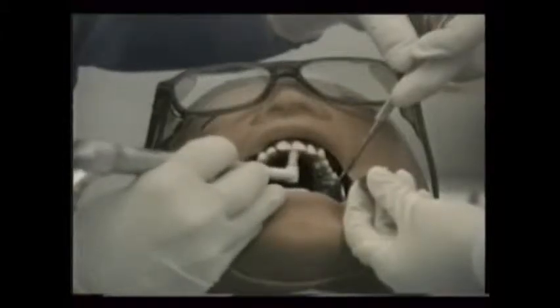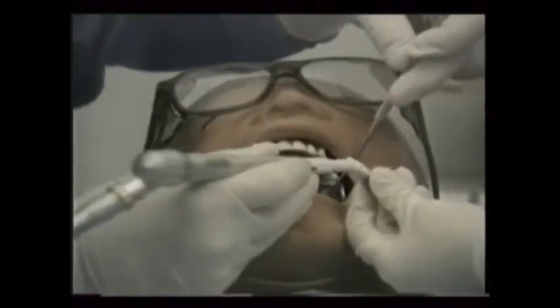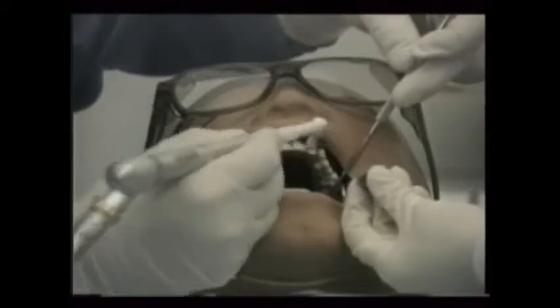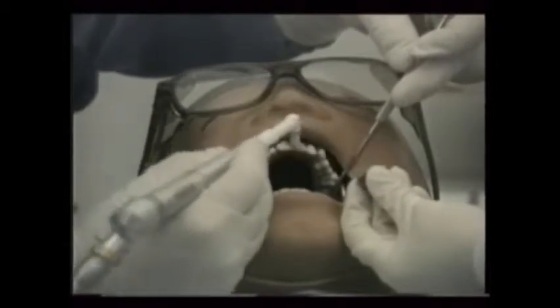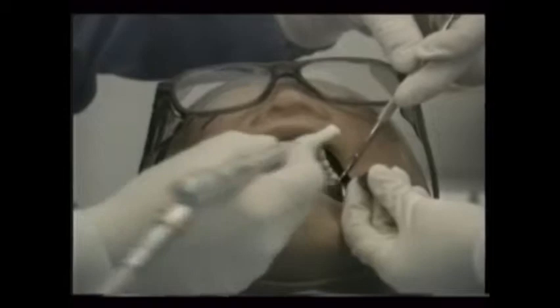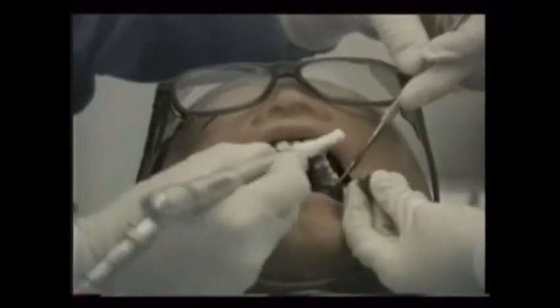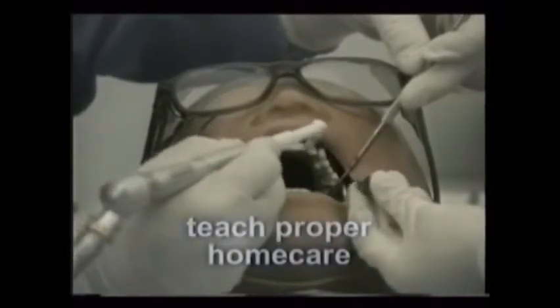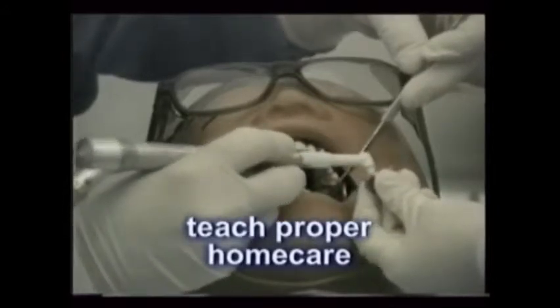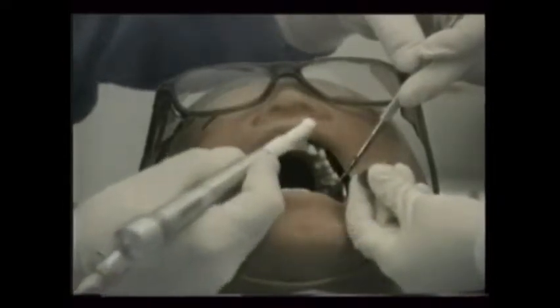Keep the paste close to the treatment area to replenish the operator's rubber cup or brush, and also help the patient by rinsing and evacuating excess polish during the procedure. After treatment is complete, it may be your responsibility to teach proper home care to the patient. A basic review for your benefit is presented at the end of this film.